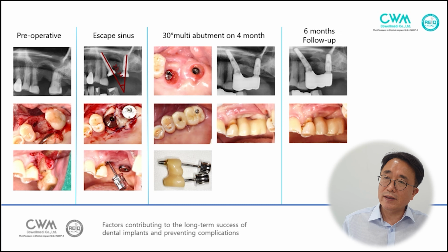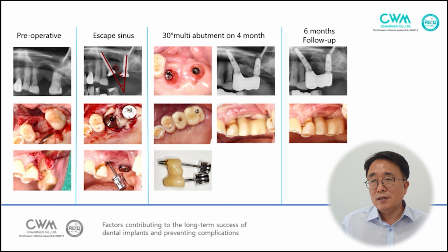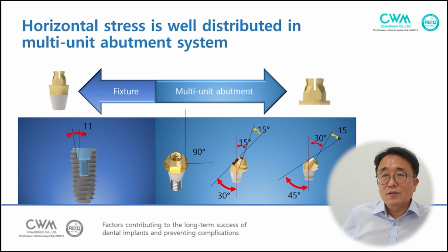So direct fixture connection and bridge framework design is very dangerous. Please don't use direct casting technique in bridge. Single crown is okay. So here, horizontal stress is well distributed in multi-unit abutment system.